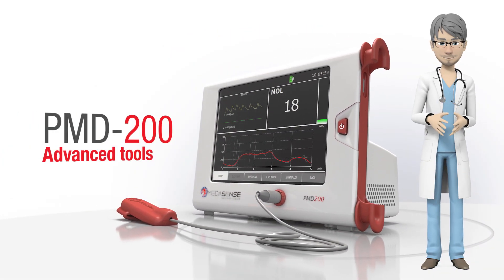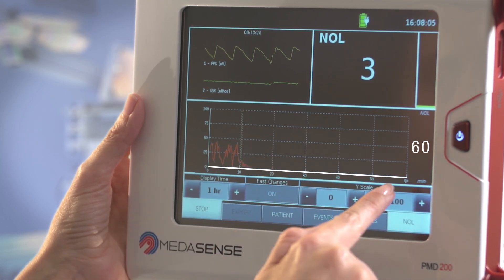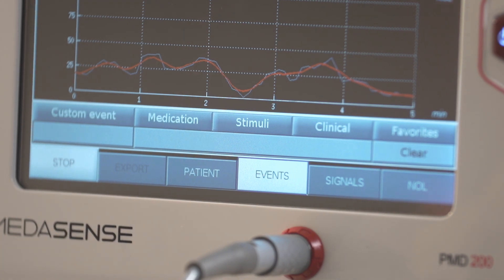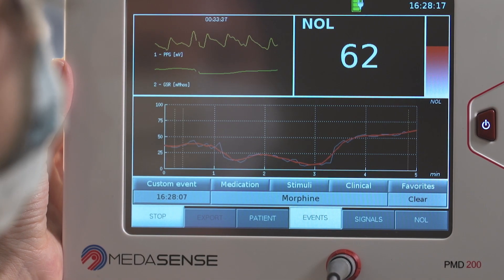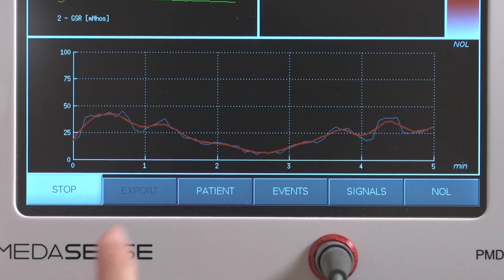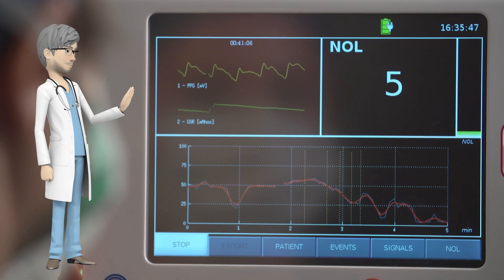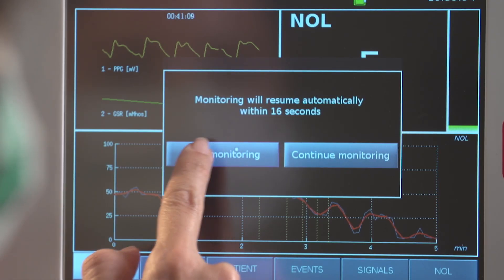Advanced tools. You can adjust the NOL trend time scale by pressing the NOL button and selecting the desired display time. Press the Events button if you wish to annotate any stimulus, medication, or clinical situation and choose an annotation. A thin yellow line will then be displayed on the trend line. You can also enter the patient's demographic details for future analysis. When the surgical procedure is complete, remember to press Stop to save all recorded data.